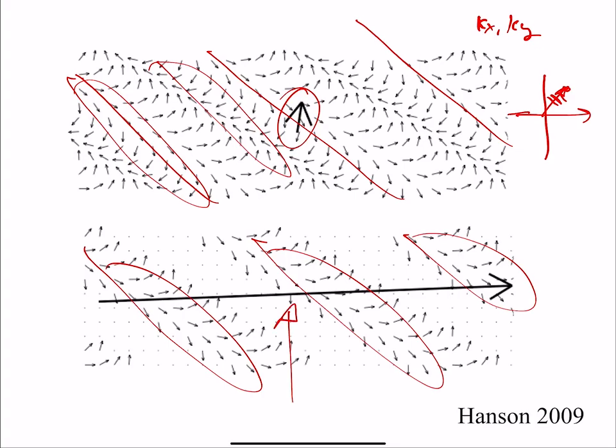Question? So you get something that's not representative of what you're actually imaging if you take away all the variables? In this case, I'm saying I'm imaging a different object. So there's object 1 and object 2. I'm just saying if I have two different objects, one object is a better fit for this Fourier component than another object.